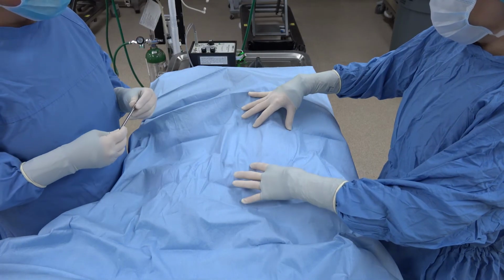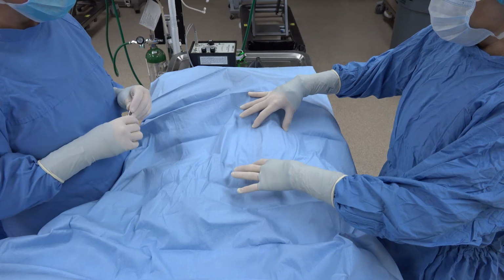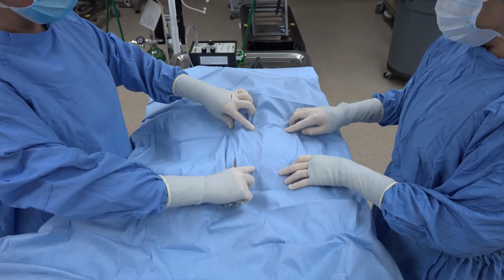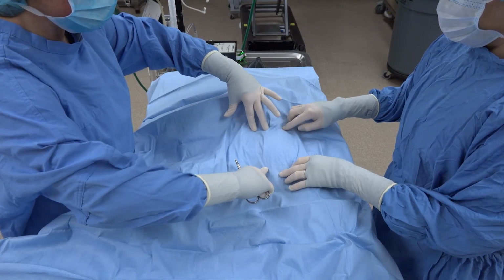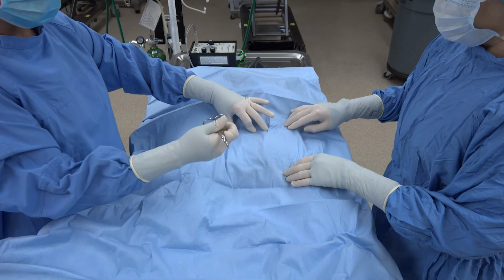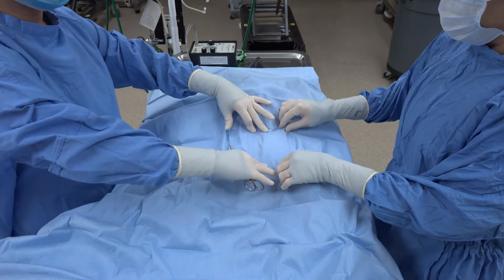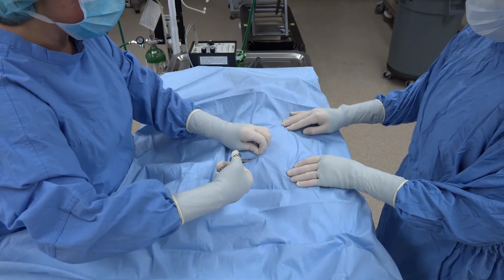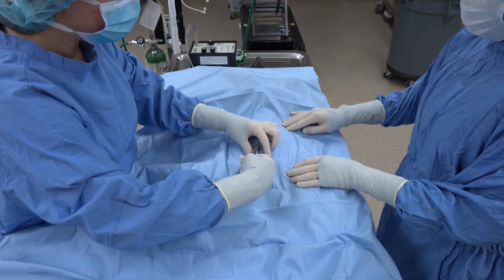So now we're going to cut a hole in the drape, and so Sue right there has her hand on her towel clamps, and then my towel clamps are right here. And so we know that between these points right here is where the hole in the drape needs to go. Now, I'm going to use my Mayo scissors because these are the biggest, toughest scissors that we have in these packs. And what I'm going to do is lift up just a little bit, cut a little bit of a hole, and then cut up.